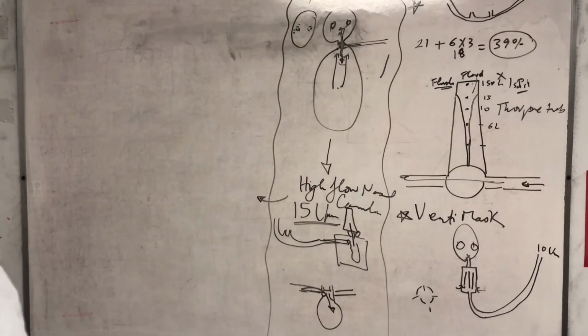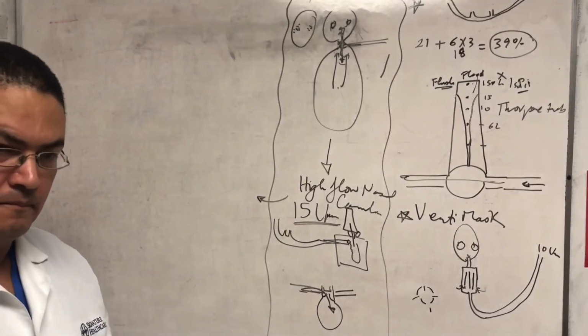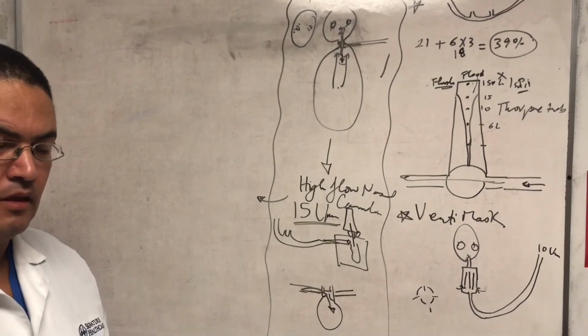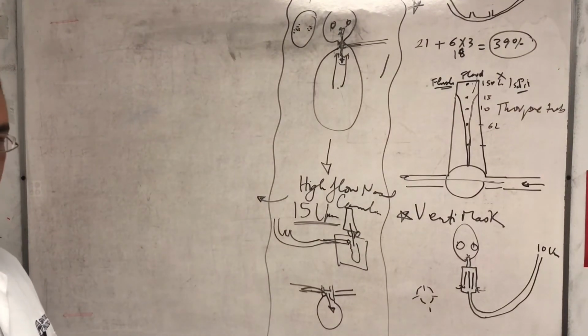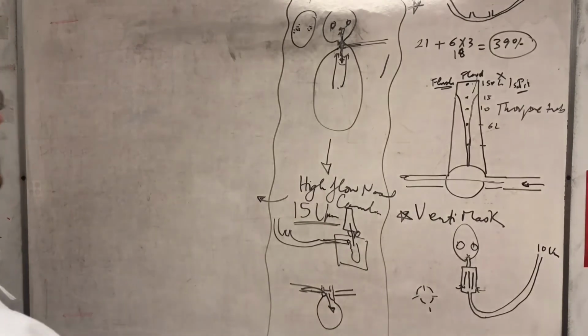Are there any structural differences between the high flow nasal cannula itself and the regular nasal cannula? Just a little bit bigger tube? Okay. It's green color, but it's bigger. It doesn't have to be bigger, by the way, but bigger just makes it a little bit more comfortable, so the flow doesn't hurt the patient.